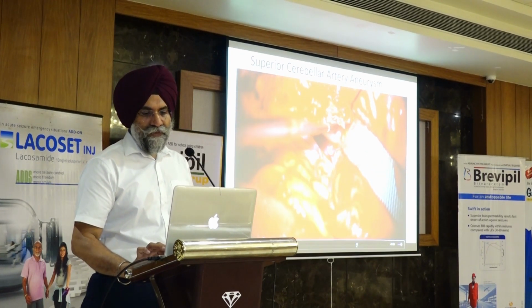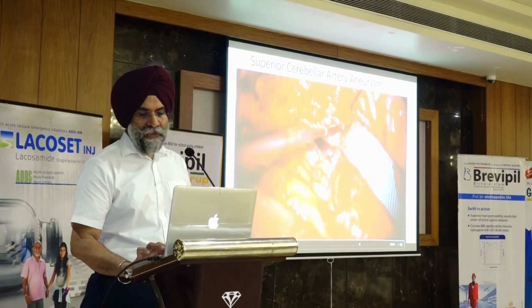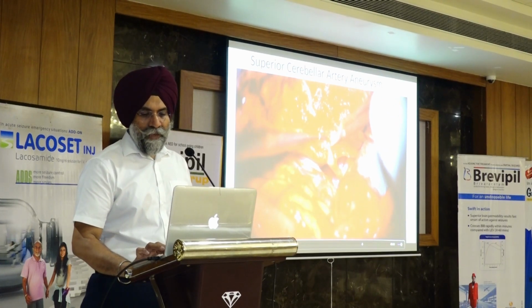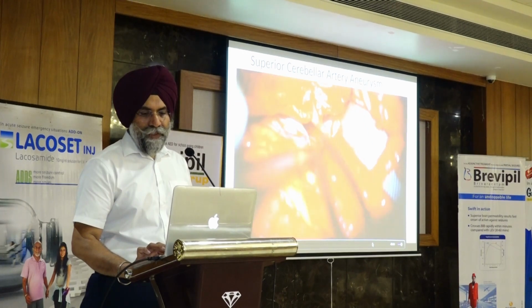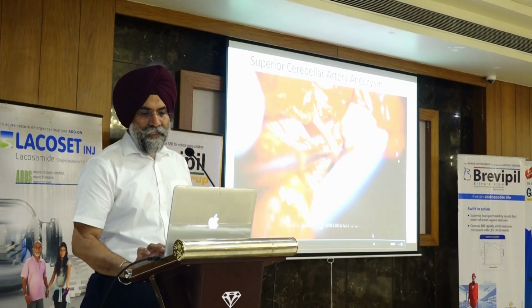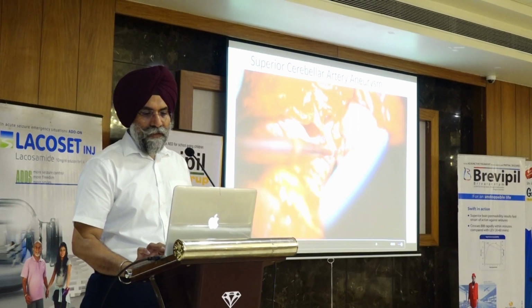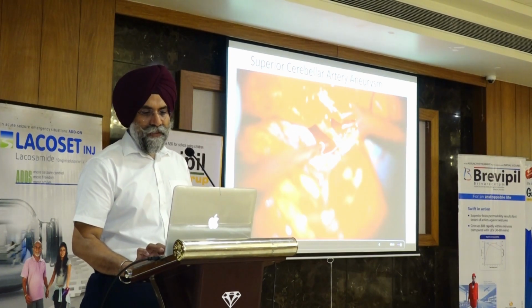Once the third nerve is mobilized a little bit further, we have got control of the proximal part, the upper part of the basilar artery. So appropriate lengthening is done so that we can manipulate. Once that is done, maybe a temporary proximal clipping of the basilar trunk is done, and this is the aneurysm. This is the superior cerebellar artery. This is PCA. This is PCA.